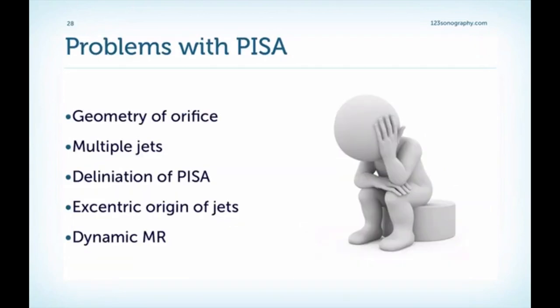So okay, we have reference values. The methodology has been proven and shown in many publications that it works. True, the formula is quite complex, but in reality you do not have to memorize the formula. The calculation is being done in the machine anyway. So why don't we use it? Why don't people use it more frequently? Well, in reality the problem is that there are a number of limitations and problems.